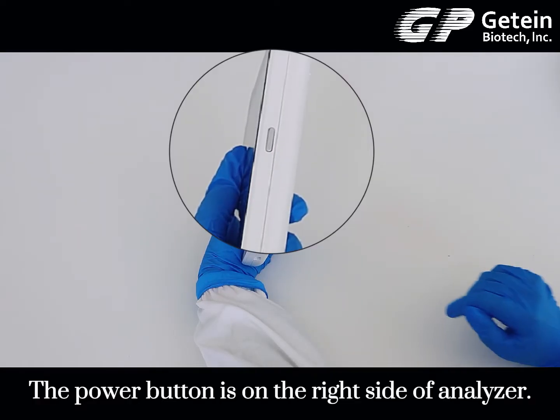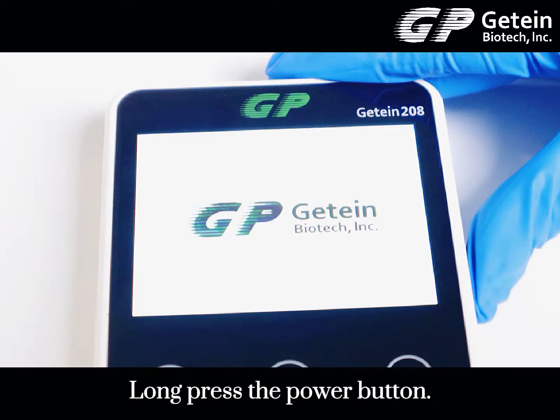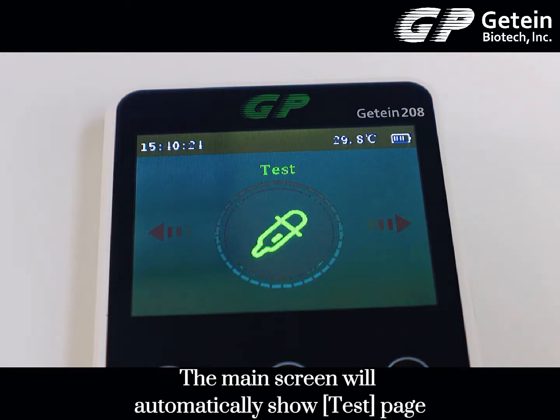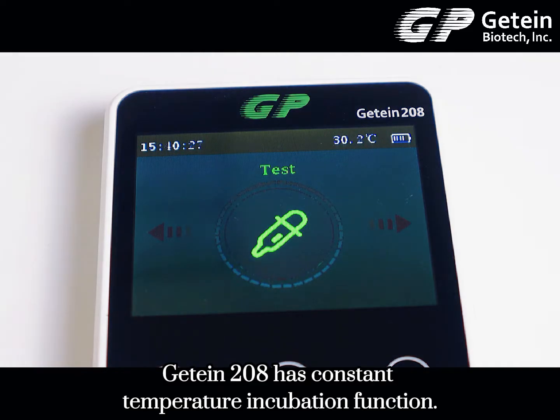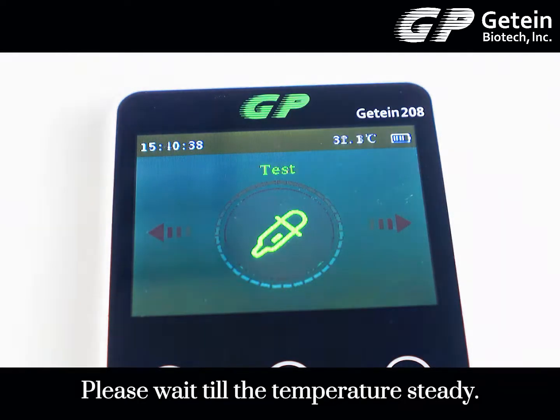The power button is on the right side of the analyzer. Long press the power button and the main screen will automatically show the test page. The JETEN 208 has a constant temperature incubation function. Please wait until the temperature is steady.